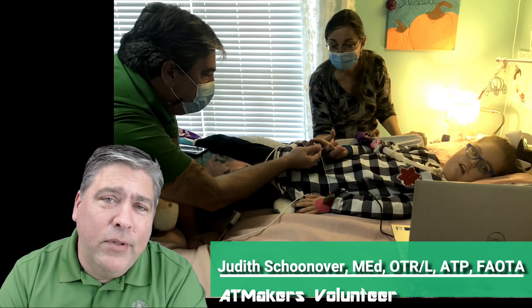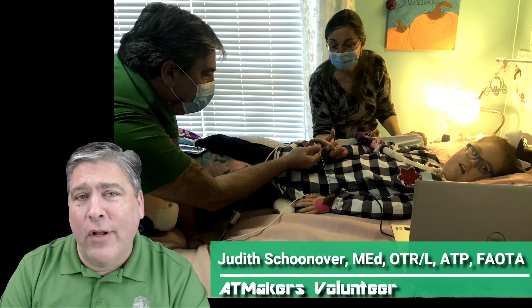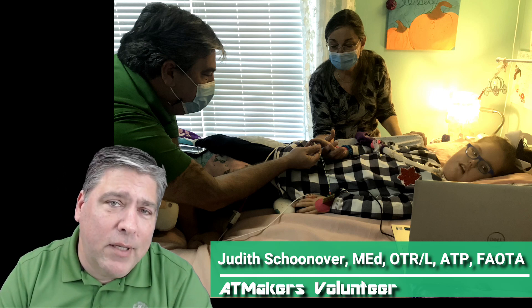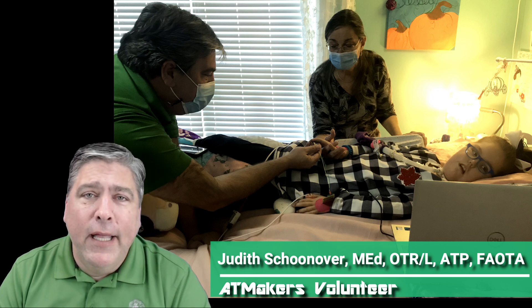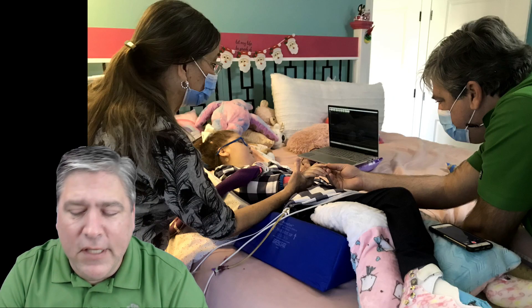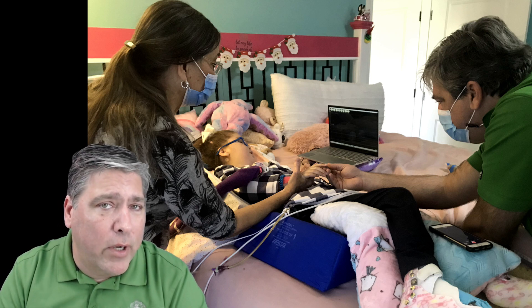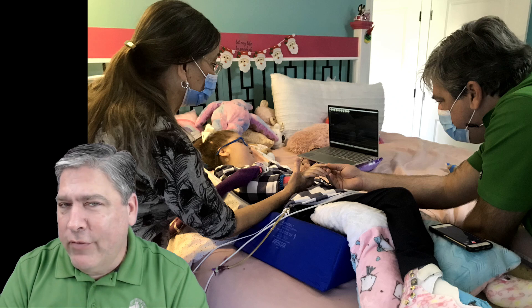Thankfully, I was not alone. Judy Schoonover, a longtime friend of ours and a kind of world-renowned occupational therapist, was able to come down from Michigan and meet me. We spent the afternoon with Ella trying different sensors, different positions, talking to her about what she wanted to do going forward, what her priorities were. It was kind of a great day.